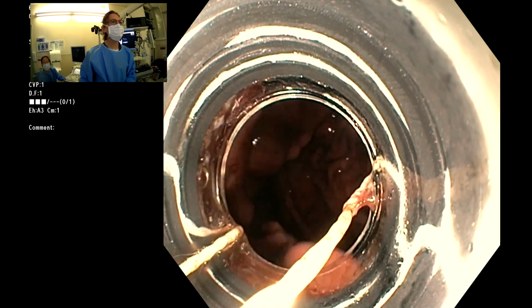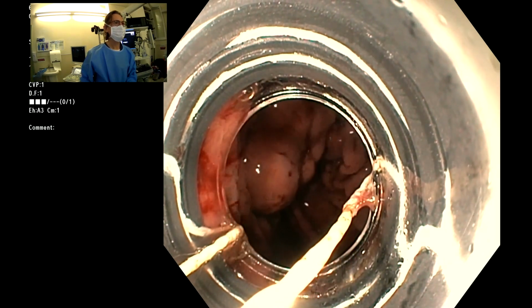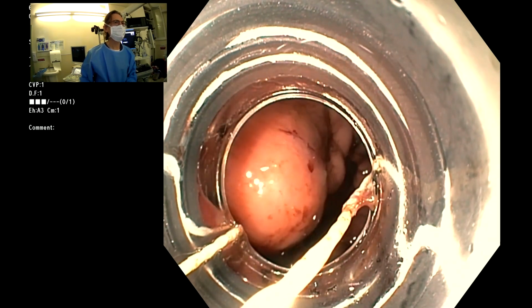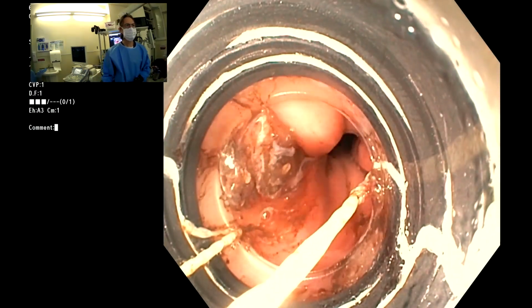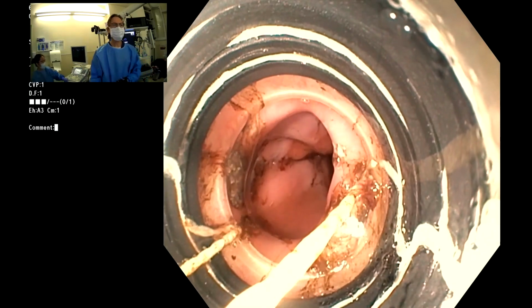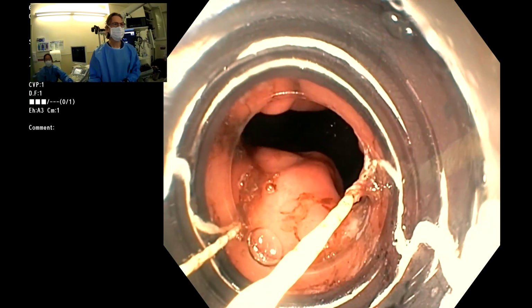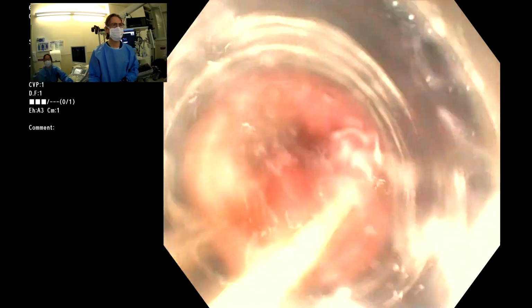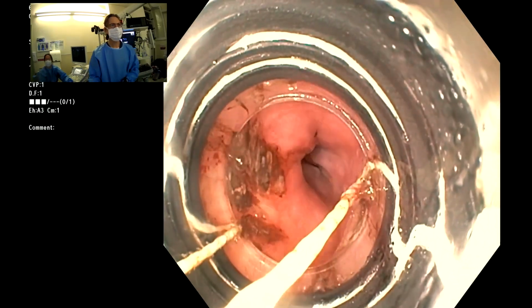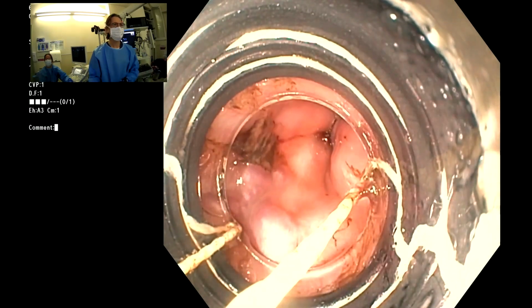But it looks really good. You see there's no bleeding. This is just some neighboring mucosa here, but definitely no bleeding from the varices. And we will go back to the esophagus now, and right at the cardia, I don't see any varices. This is the cardia. And I don't see really any, or maybe very subtle, but they're small, not worthy of treatment. And here's where we usually start our banding, but I don't see any varices here that are noteworthy.